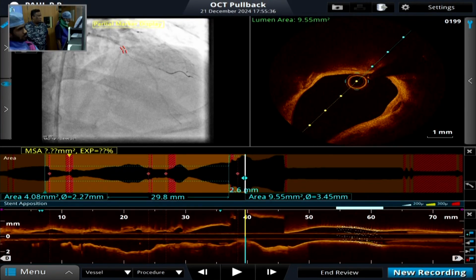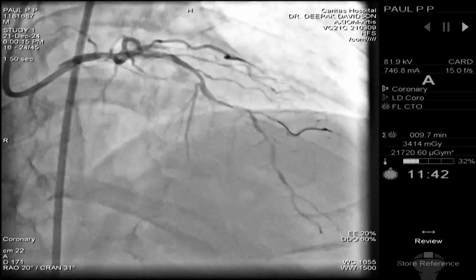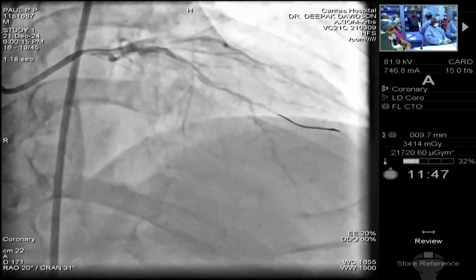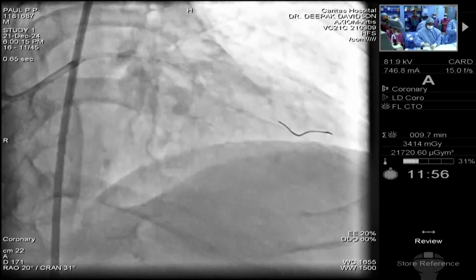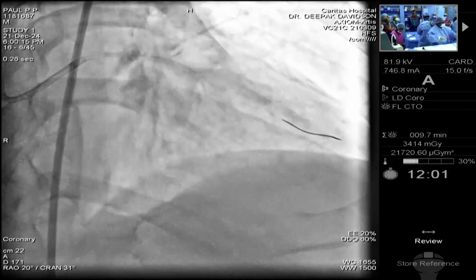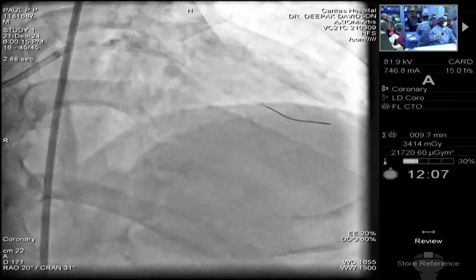In diffuse calcium, see, actually she asked a question. This morning we saw a case wherein it was only that LAD D1 bifurcation. It was a very discrete lesion, less than 10 millimeter length. So you are sure that it's orbital there, because it's a big vessel. It's a discrete lesion, 10 millimeter only. You know that 5 passes slowly or 8 passes very slowly, you would get a huge luminal gain. So you are sure about it.